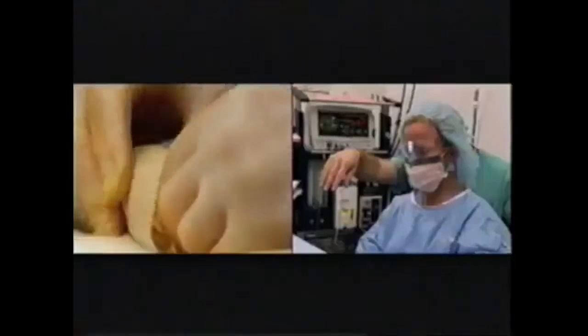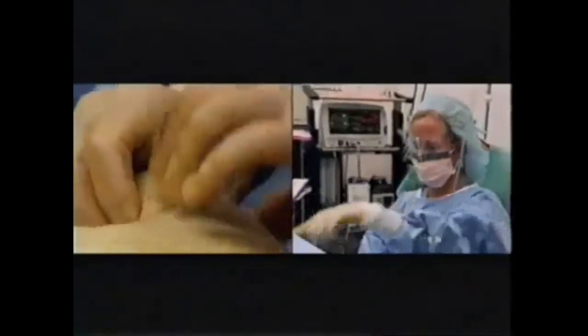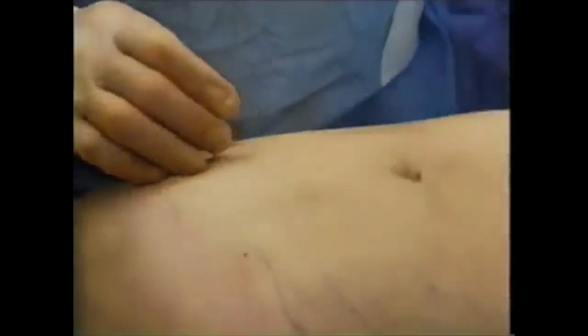Suction off. This flap here actually feels very thin. I don't want to go any thinner than this anywhere, but with this little pinch test, you can roll your way across and see. We actually pinch the skin and see how thick the layer of fat is and determine how much fat was left under the skin. This is thicker, right in here. Power on. Well, I think we're just about there for the abdomen. Now we're going to do the inner thigh.